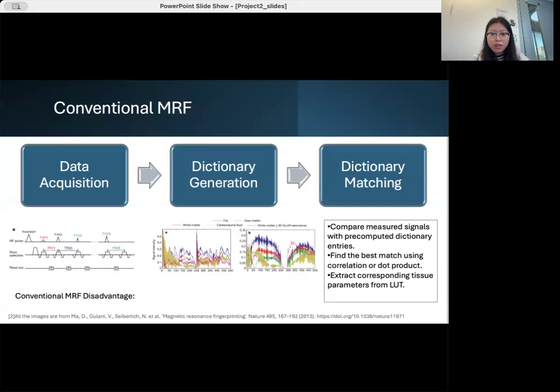By varying the acquisition parameters, unique signals are generated from different tissue types, and the dictionary entries are created by simulating the acquisition sequence on a range of parameters, representing different biological tissues based on the Bloch equations.